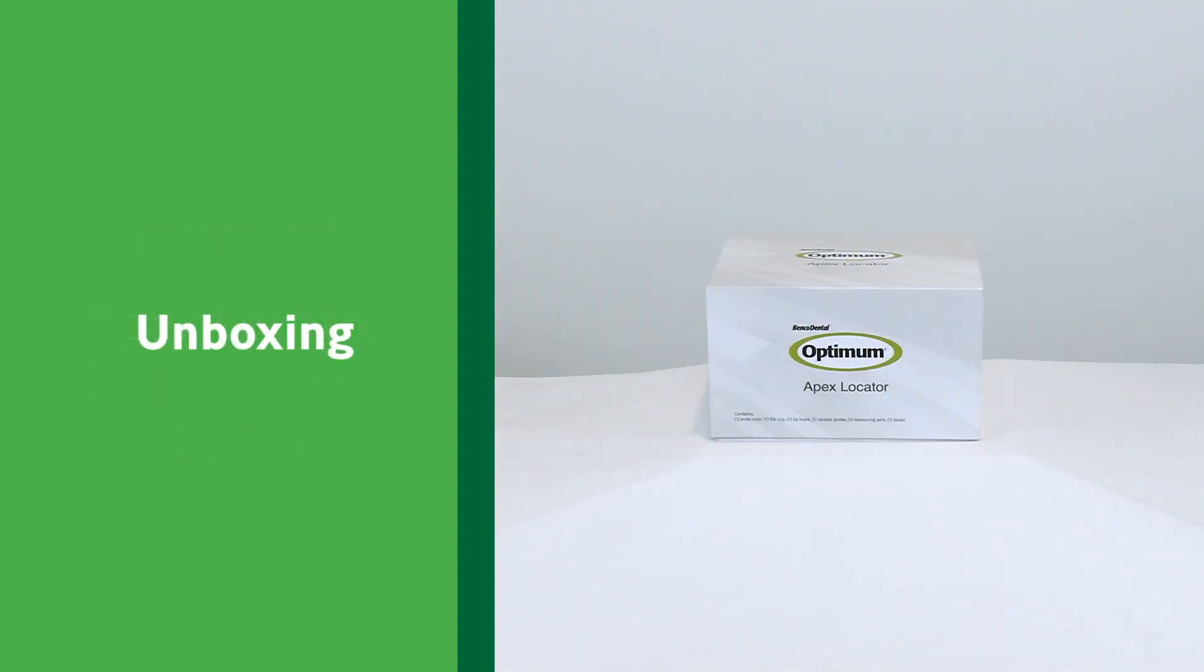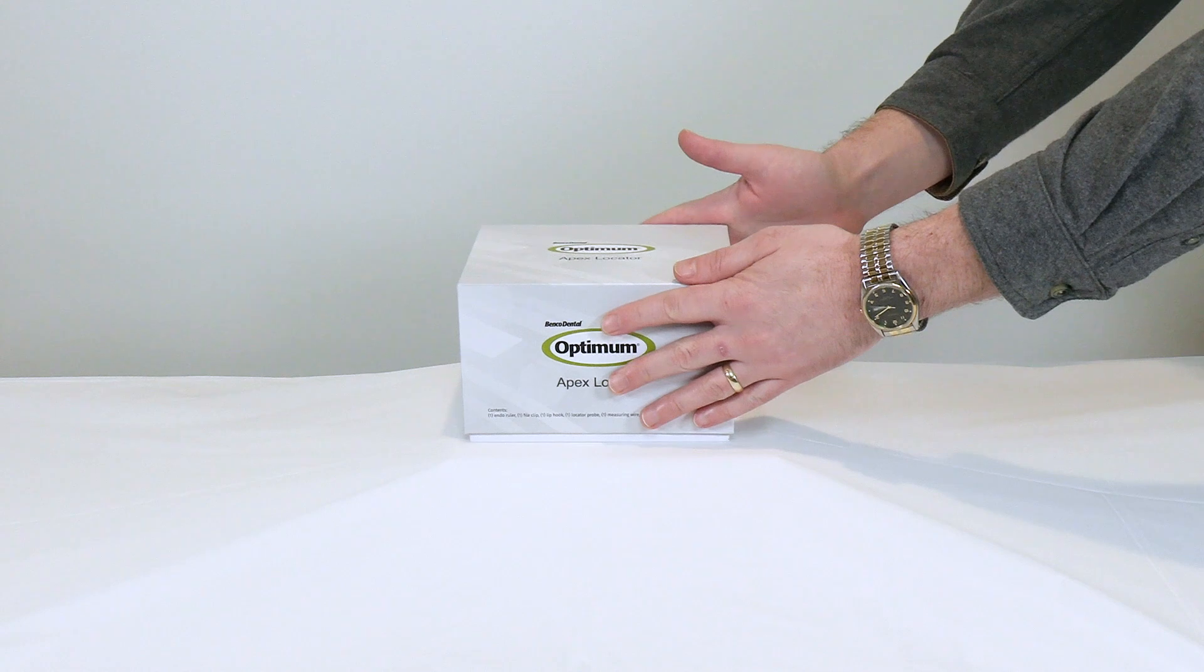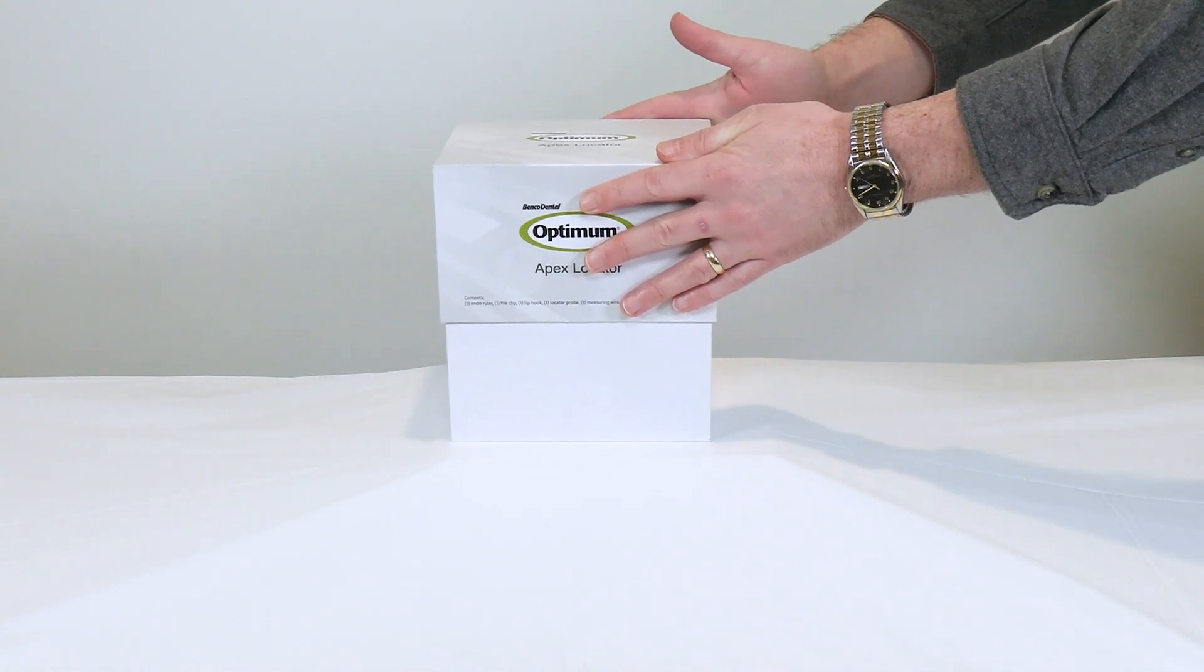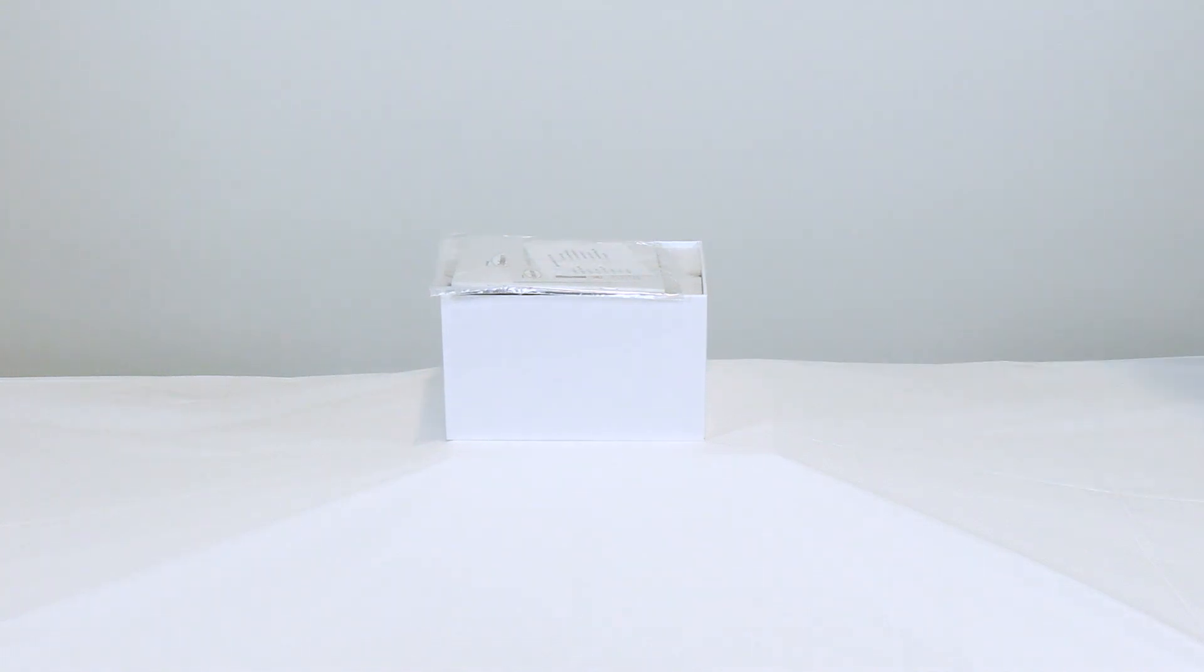Unboxing. To begin setting up your Optimum Apex Locator, first open the box which contains the locator unit and all main accessories.